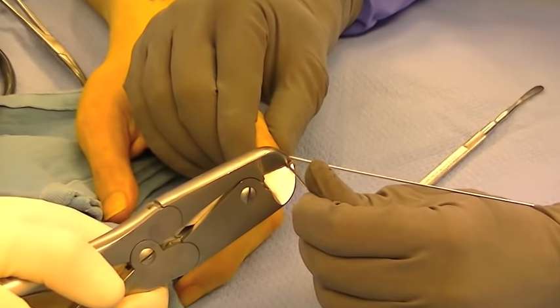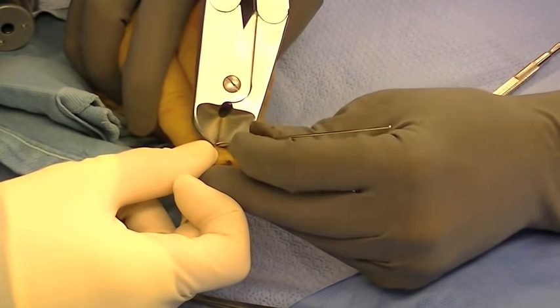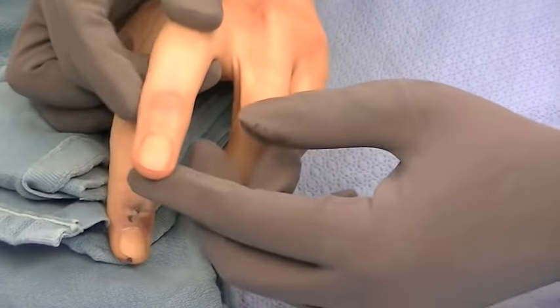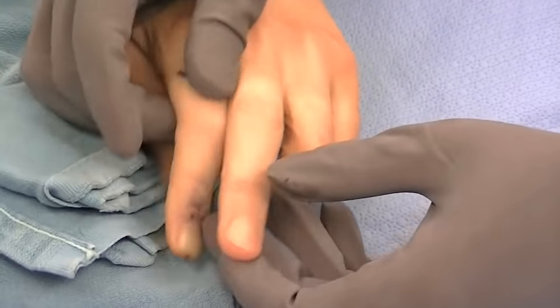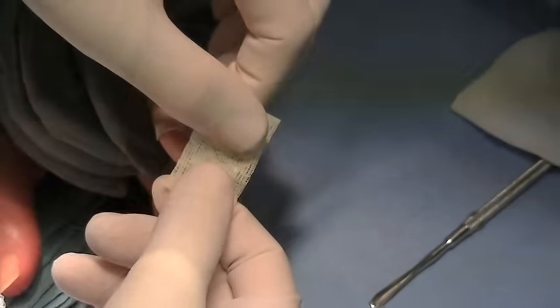They're left in place for approximately two months. A bulky dressing is applied initially, and then this is converted to a small orthoplast splint that can be made by therapists in order to protect the fingertip from any trauma.